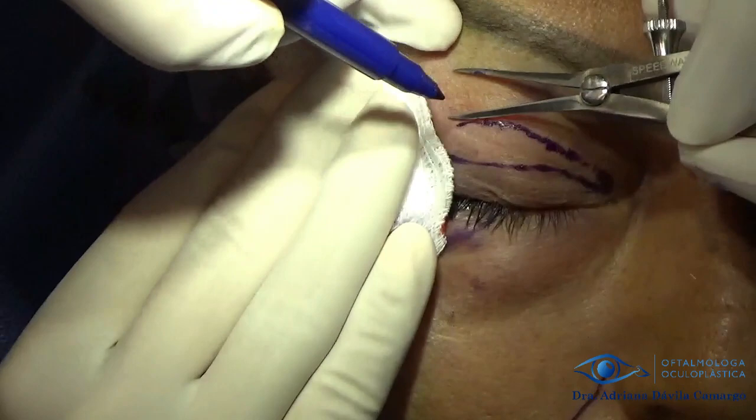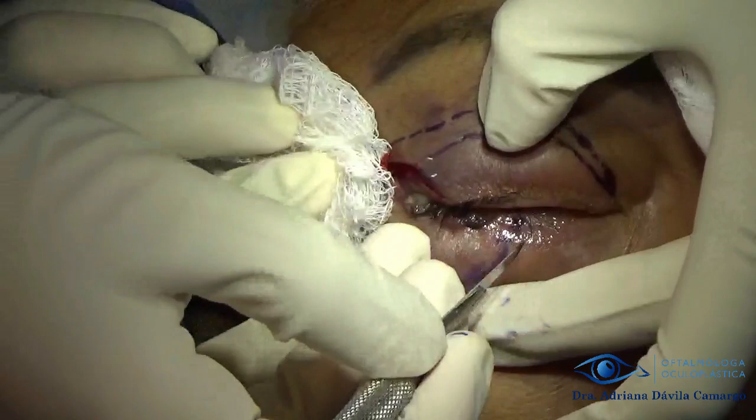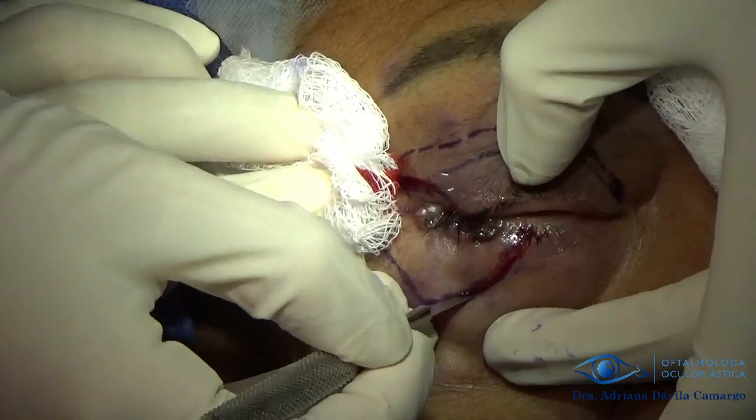Here we are marking where we are going to remove the Trippier flap, which consists of skin and muscle from the upper eyelid for the reconstruction of the lower eyelid. I like to leave 10 millimeters of skin under the eyebrow so that the patient does not have post-surgical ptosis problems.